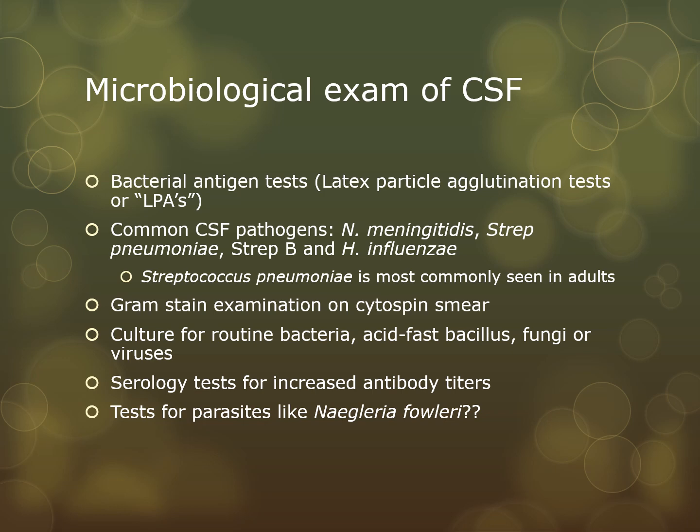Culturing for routine bacteria, acid-fast bacillus, fungi, and viruses is pretty standard operating procedure for cerebral spinal fluids. We also can do serology tests for increased antibody titers, and then we can also do tests for parasites like Naegleria fowleri.